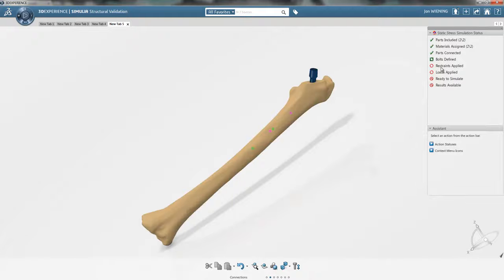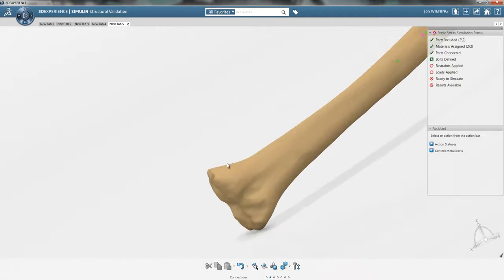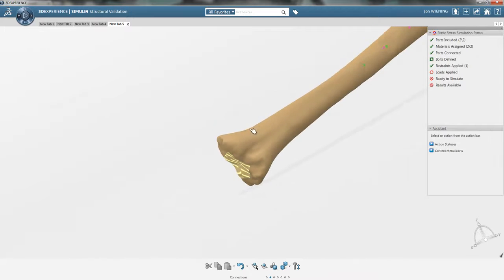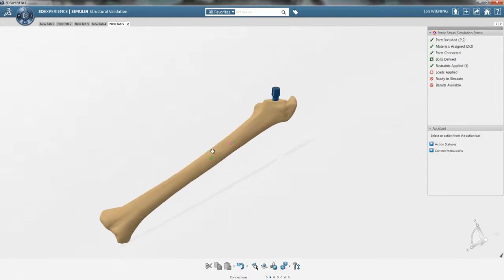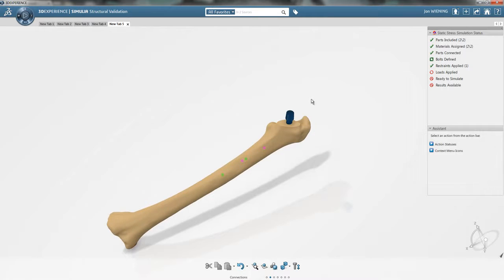I need to apply restraints. In fact, I just have a simple restraint that I need to define at the knee joint region. So let's just select some surfaces here that I will clamp. And we'll apply a clamp definition, and you can see that we now are complete with respect to having the required restraints applied. And our next step is to apply a load.